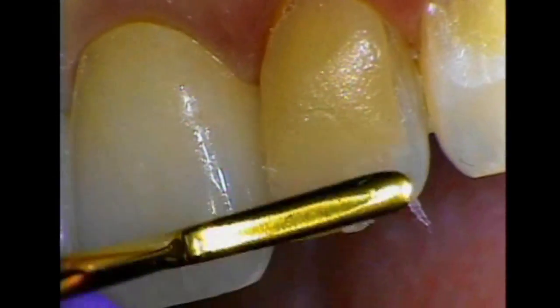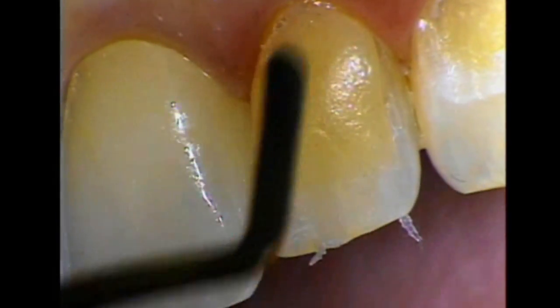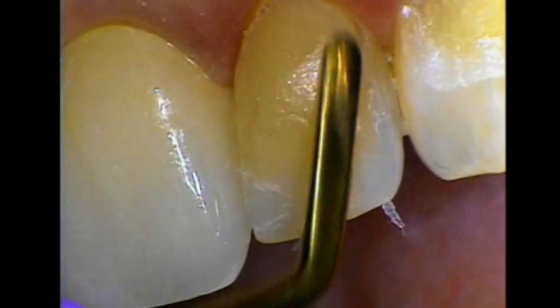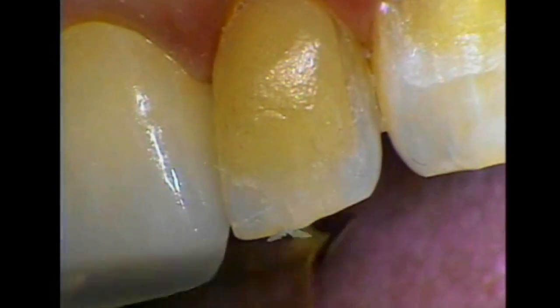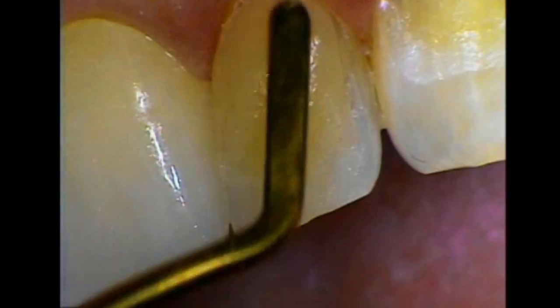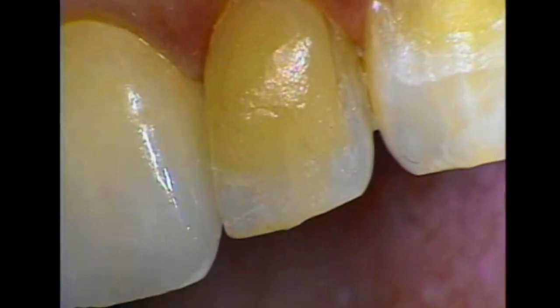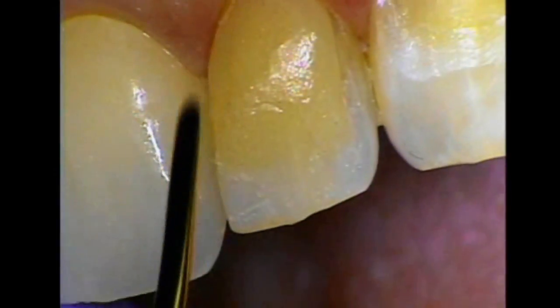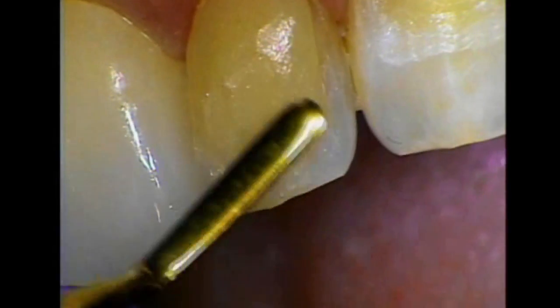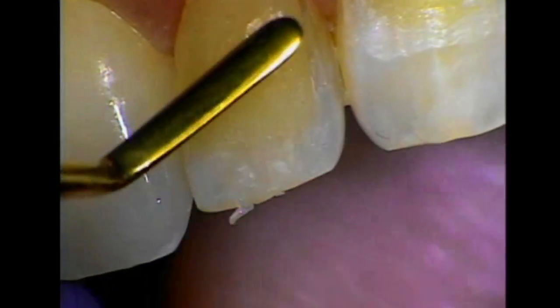I use light — I'm not a brusher, I'm a sculptor. If you want to brush you can, but I don't. You can see I'm going to take this paste past the long bevel and blend it up onto the tooth surface. Everything is done very gently. I'm adding, sculpting, shaping it, taking it down just slightly beneath the free margin, blending it onto the tooth surface, using a very light touch. You don't need heavy touch.